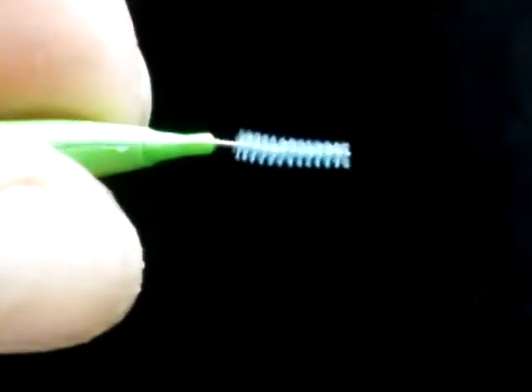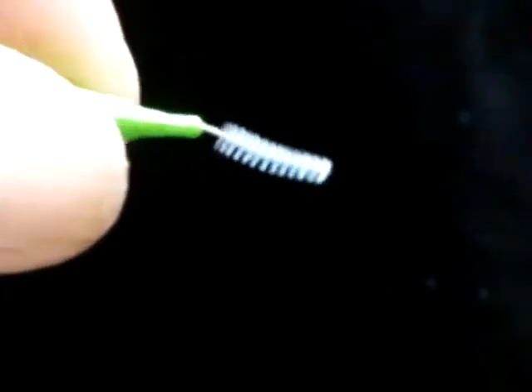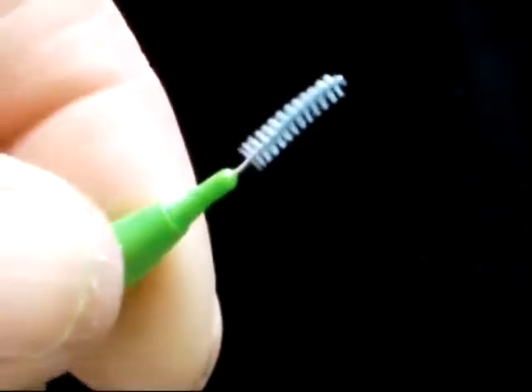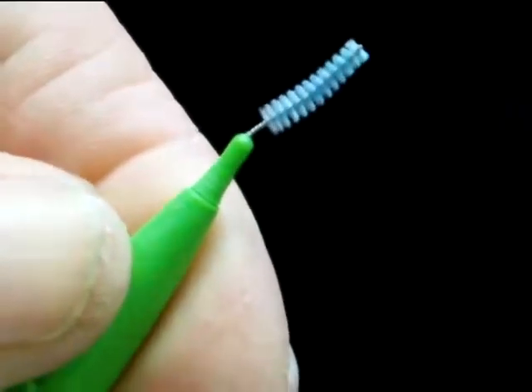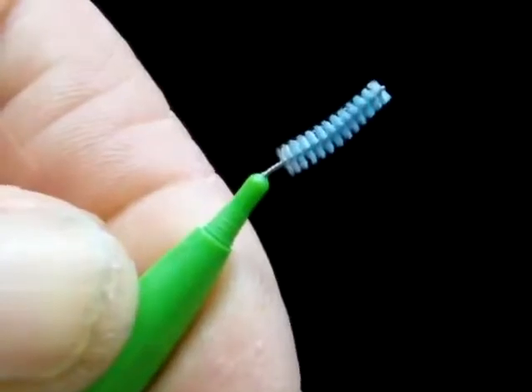They all have thin, flexible whiskers attached to a rigid spine, a metal spiral in this example. The flexible whiskers bend smoothly up to their root, where the unyielding spine forces them to bend sharply. This is a classic mechanical problem, sometimes described as the way to cut a wire without wire cutters.